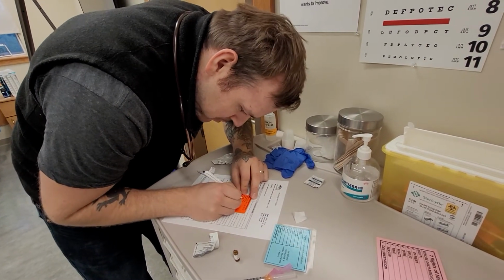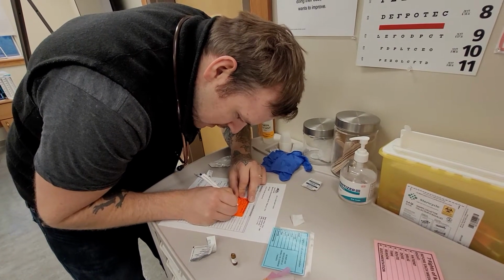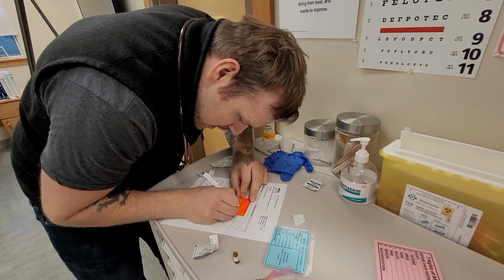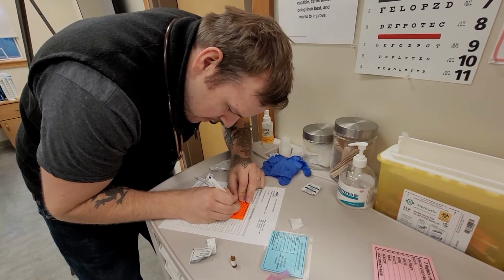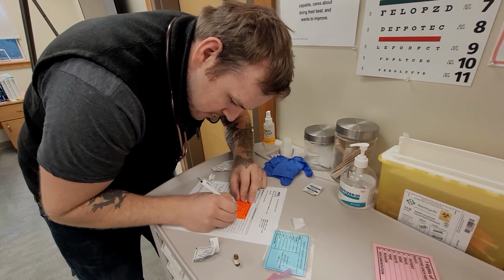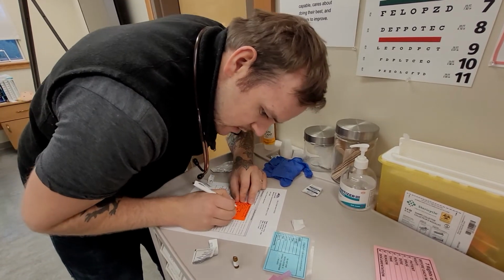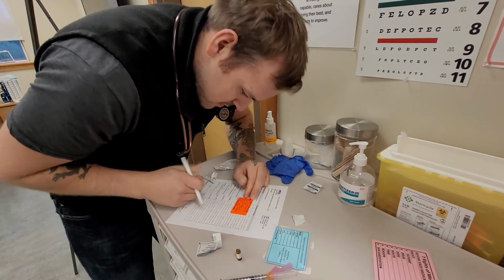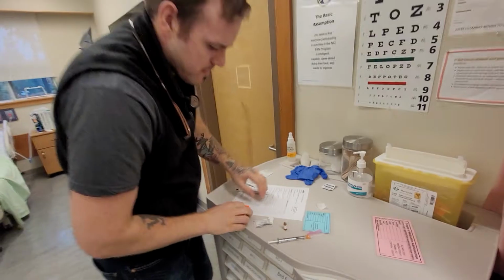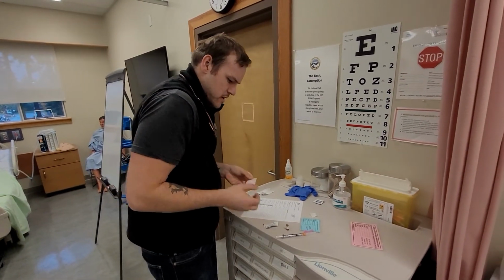Added by, I'm going to put my initials, BK, NICBSN on there. Today's date, November 3rd. Time, we're going to go 10:30. Expiry, we know that it's 12/20/30. There we go. And we're going to fix our medication label onto our medication.